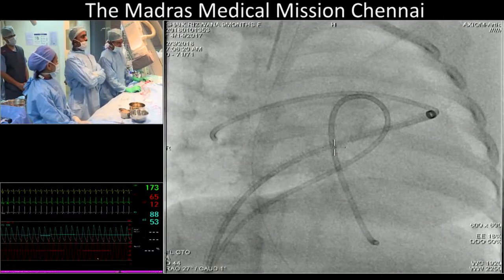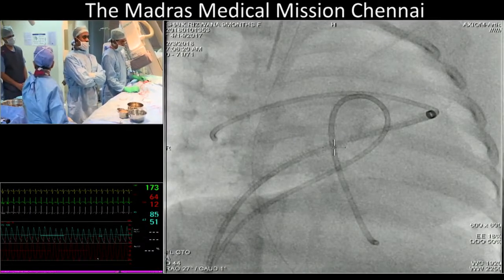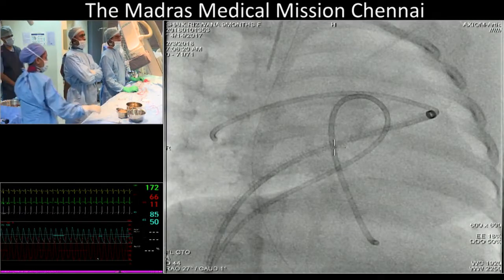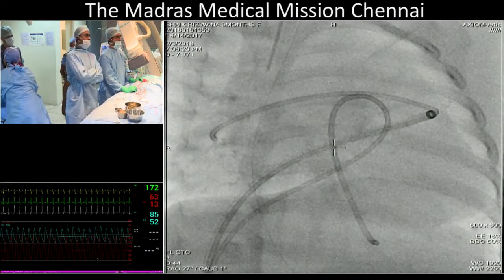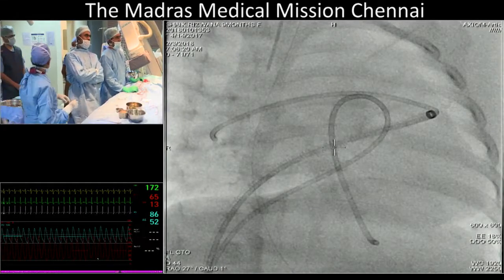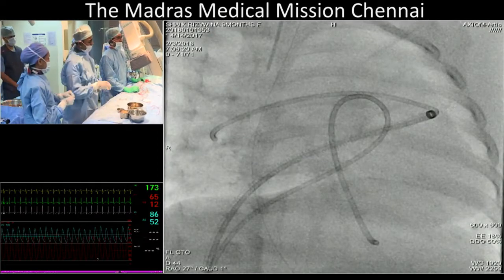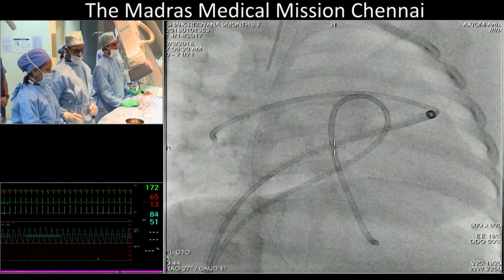I wanted to know the impression of the entire house. If you are having a near systemic right ventricular pressure, what will be the time at which you want to intervene? You want the RV to fail and then intervene? This patient had features of diastolic dysfunction with elevated right atrial pressures of 14 millimeters and elevated right ventricular end diastolic pressure. It was not a failing RV.